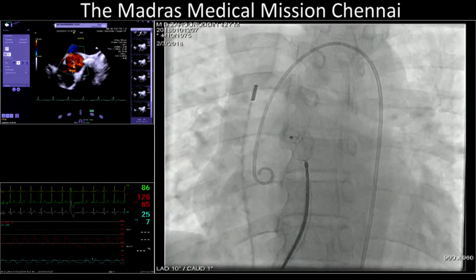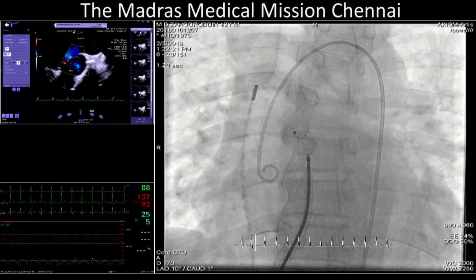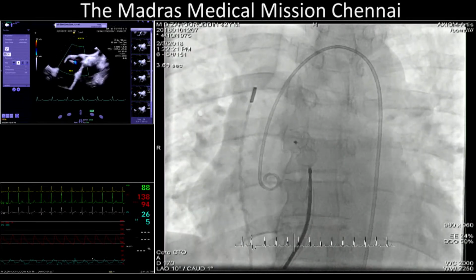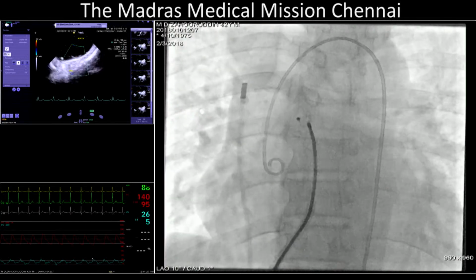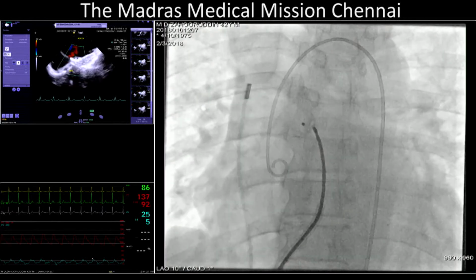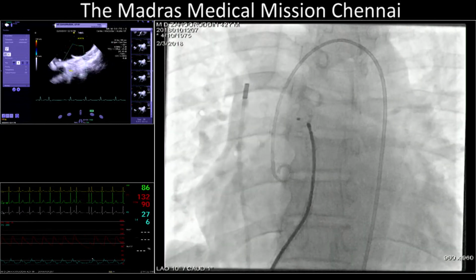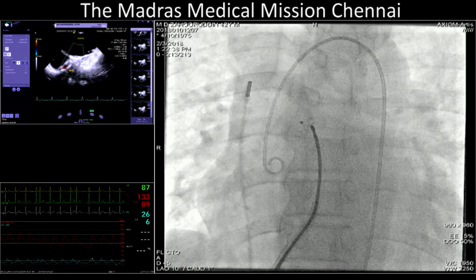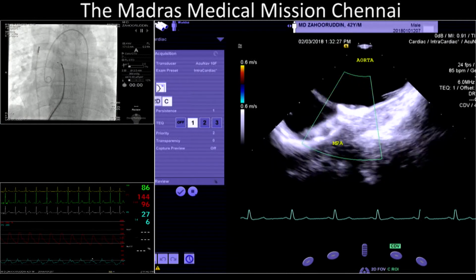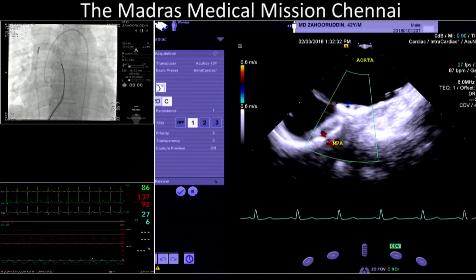Yeah, so you have the waist have a little bit of an obstruction maybe, and that might be the proper size of the device, isn't it? This is your intention, to find out that the waist has to be a little bit obstructed. Yeah, actually right now. Make the echo bigger. Echo bigger. Okay. Almost we have stopped the flows.